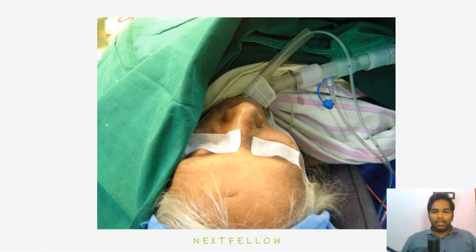Now this is an actual patient who has been intubated with a ProSeal LMA. Through this gastric desufflation port, we have inserted a Ryle's tube. Can you see it? Through this tracheal tube, we are ventilating the patient. Through the gastric decompression port, we have inserted a Ryle's tube. So this is very advantageous.